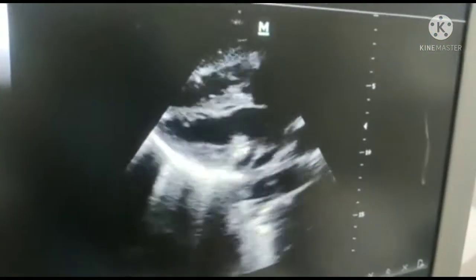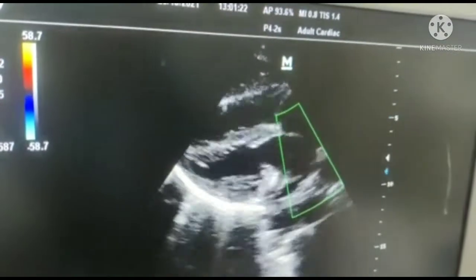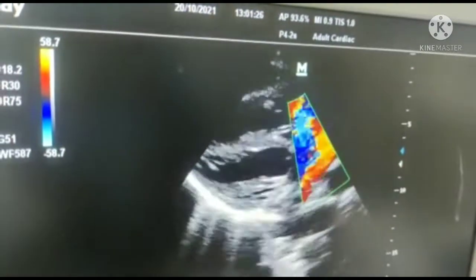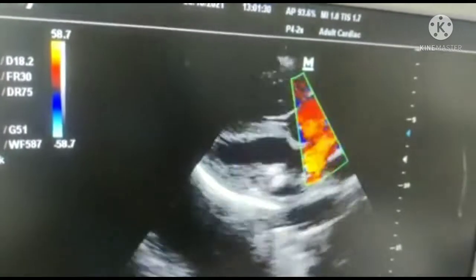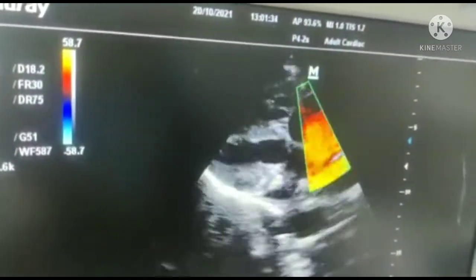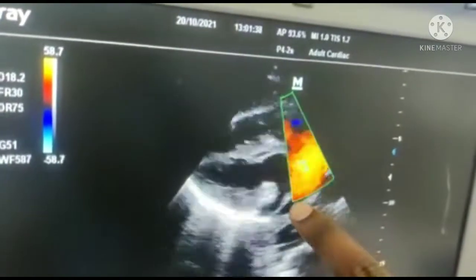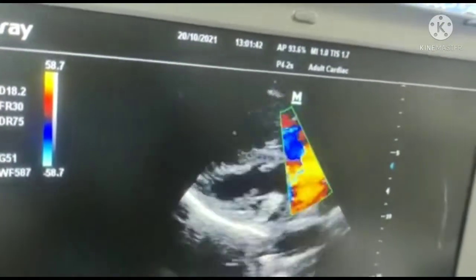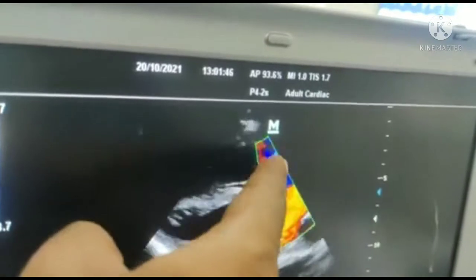Can we demonstrate the shunt? Yes. In color Doppler, you can see the flow from the left atrium to the right atrium. The chamber below is the left atrium and the chamber above is the right atrium. So the chambers are LV, LA, RV, and RA.